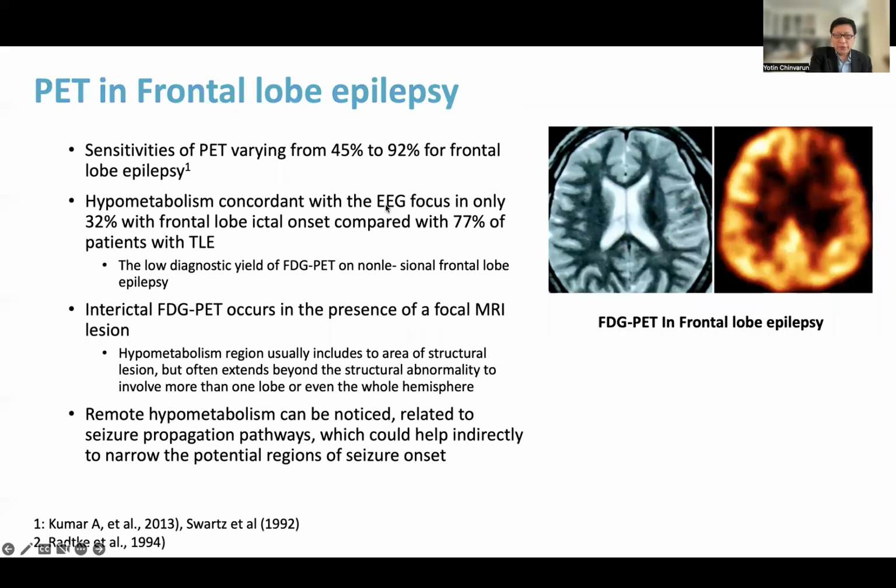How about PET in frontal lobe epilepsy? The sensitivity of PET varies from 45% to 92% in frontal lobe epilepsy.